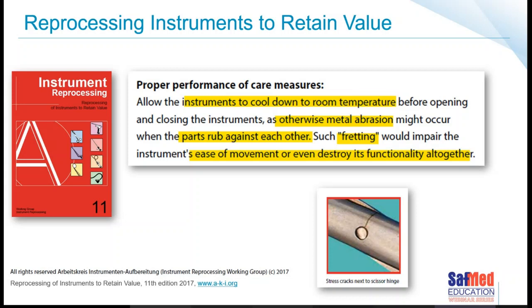I see they've also launched two other guidelines, which I'm hoping to get as well in the near future. In there, they make the following recommendation, and it's a very important point, because as you take your instruments out of an automated washer disinfector, remember they are going to be quite warm. I'm going to pause here for a second. Justin?